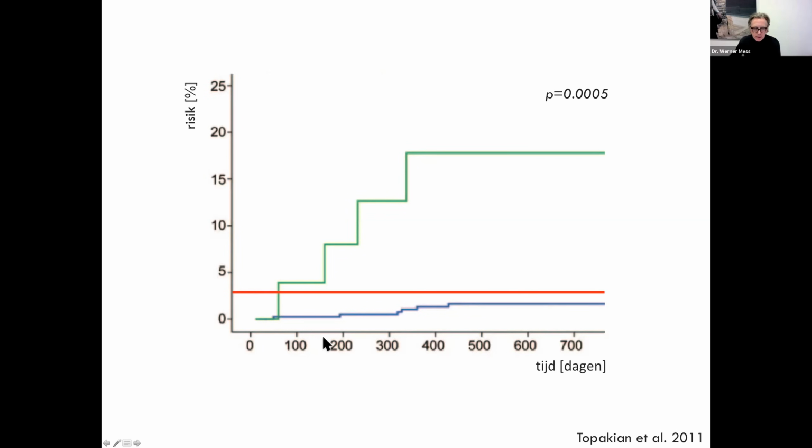And you can clearly see that if you have no emboli and your plaque is not black at the same time, you are very well below that line. So it might not be a good idea to undergo surgery. On the other hand, if you belong to this group, you should have a clear-cut advantage when you get operated on.